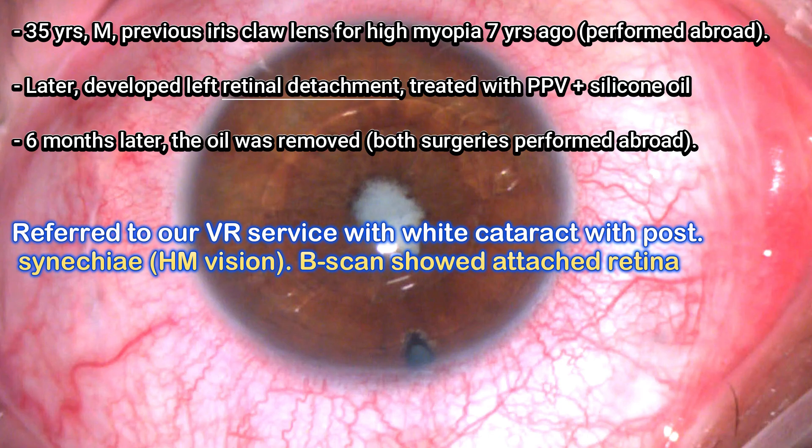This is a young gentleman who had previous bilateral iris claw lens implantation for high myopia. Unfortunately he developed retinal detachment in the left eye, which was treated by vitrectomy and silicone oil. The oil was removed later and he ended up with white cataract. We did a full assessment including B-scan, which showed that the retina is attached in place.